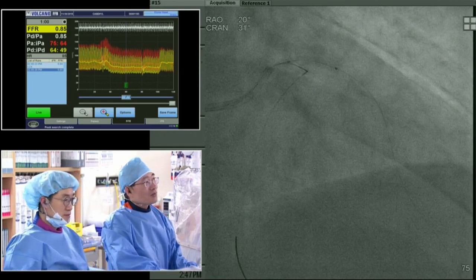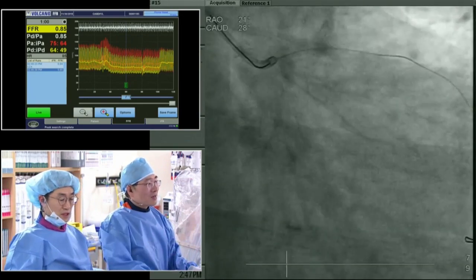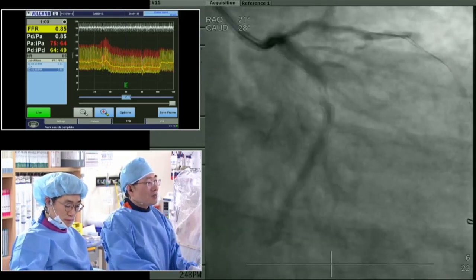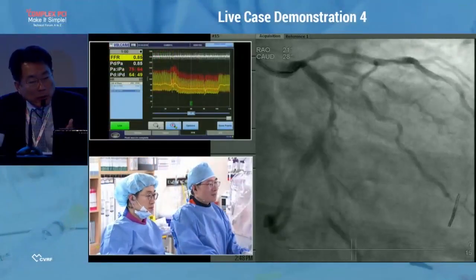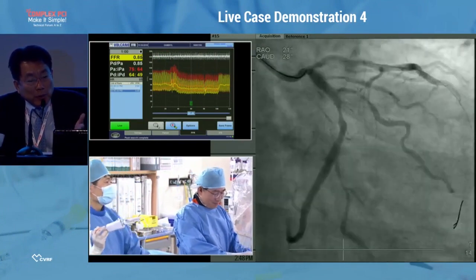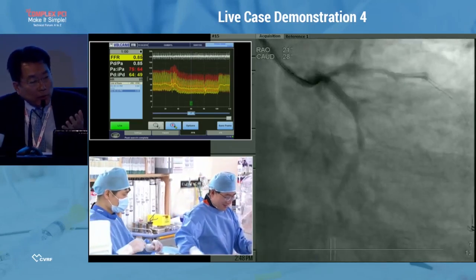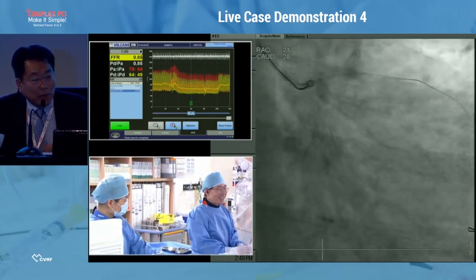But in the future, if there is some progression of the circumflex artery, it's somewhat difficult to treat at that time because we already crossed over from the right. So the LAD maybe, to Dr. Kim, it's just in case. So we have to learn. Even with whatever the 70%, 80%, if you believe a 0.85 FFR value is absolutely the absence of ischemia, we have to trust the FFR. That is guideline class 1A, right? You have already changed a lot concept-wise.